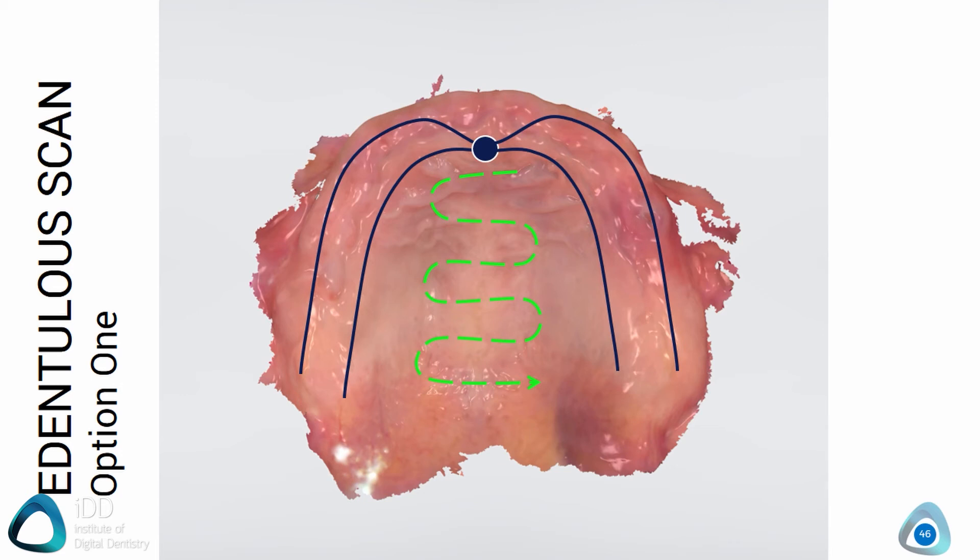If alignment is lost, you can resume the scan from the rugae area as your best reference point. If alignment repeatedly fails on the same area, you may need to remove that particular area of the scan and try again. That is your full arch upper edentulous scan.